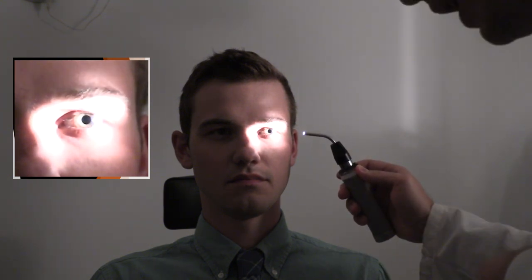Lastly, note if there is any shadow on the iris in the nasal portion. In a normal patient such as this, you will see the light able to shine all the way across the iris. However, in a patient with suspected acute angle closure glaucoma, you will see a shadow begin to creep across the nasal side of the iris as the anterior chamber begins to be pushed forward.